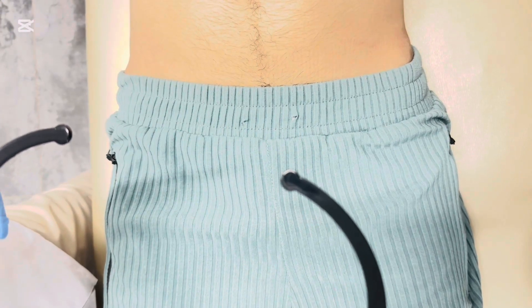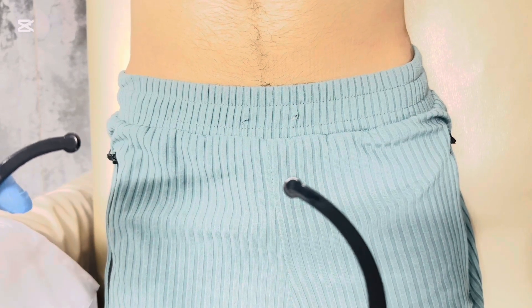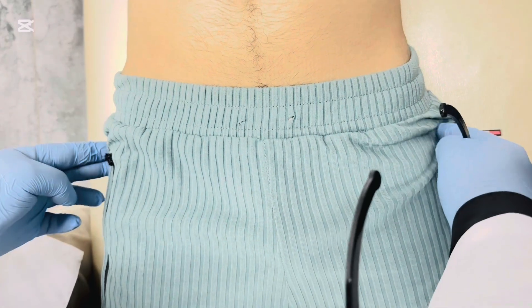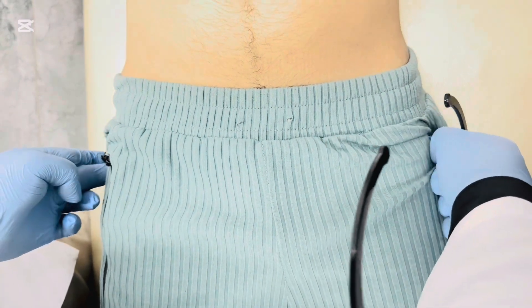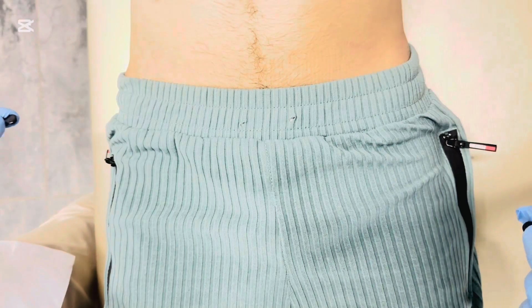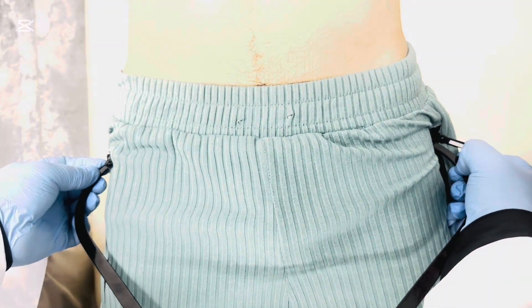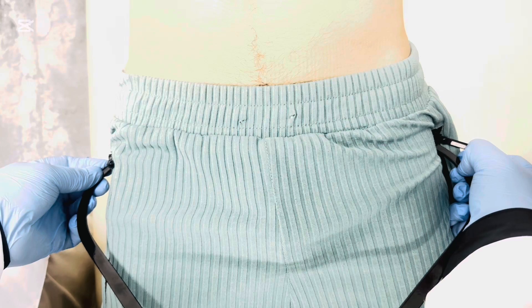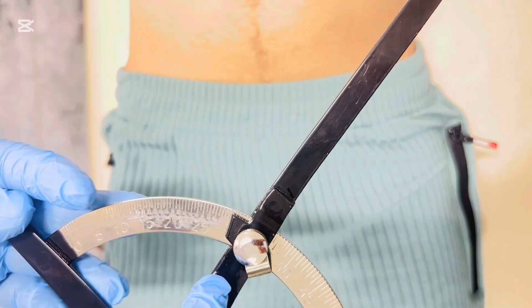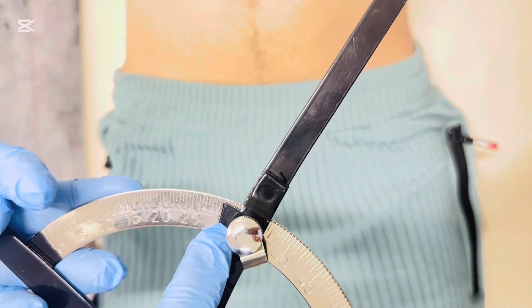Third, we have the distantia trochanterica, which is basically the distance between the two greater trochanters on both sides. Here is the greater trochanter — we palpate, find out, and measure. The normal value is from 31 to 32 centimeters, and here it reads 30 centimeters.